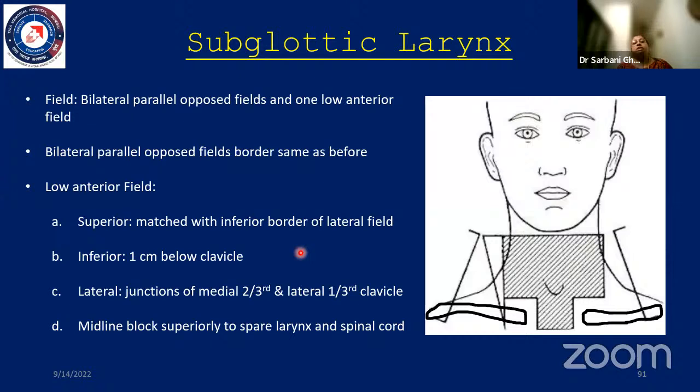Now, in subglottic larynx, typically the echelon of lymph nodes besides the bilateral levels 2 and 3 that may be at risk, the other level that is at risk is level 6. And hence it is also important for us to cover the superior mediastinum. So in the conventional setting, you would end up using a T-shaped field in phase 1 and then come off-cord in phase 2.